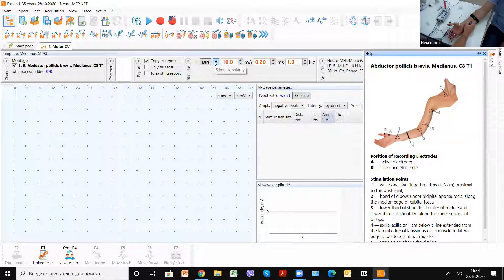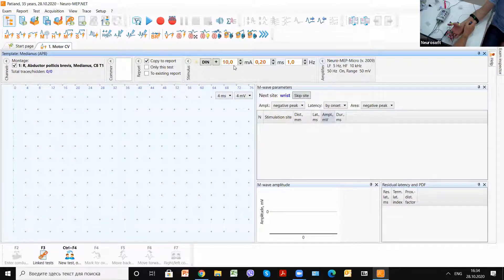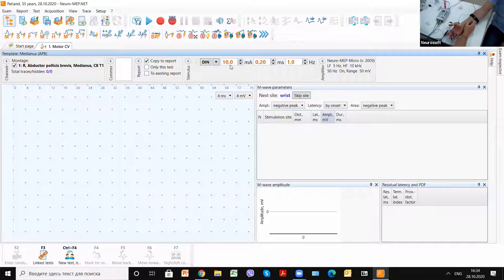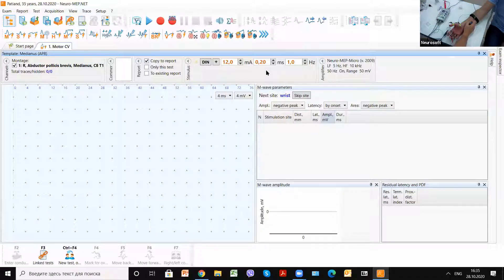For motor conduction velocity we have these parameters to set: intensity and duration of the stimulus. For most nerve conduction studies we get responses at about 10 to 30 milliamps intensity. You can use a duration of 0.1 or 0.2 milliseconds. You can increase or decrease stimulation intensity and duration using the dedicated keyboard. For motor conduction velocity we use single pulse stimulation.